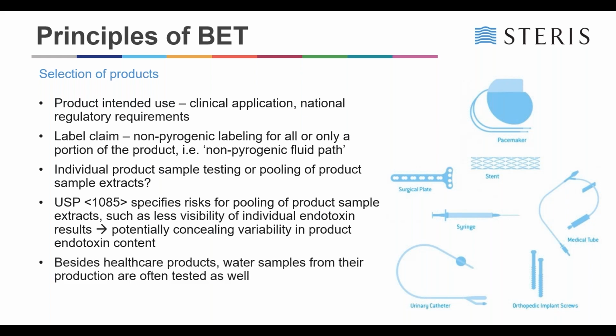So the last point here that we want to put in is that water is commonly tested as a routine sample from a manufacturing process, as the water can host the bacteria of concern and is used for some sort of monitoring control.